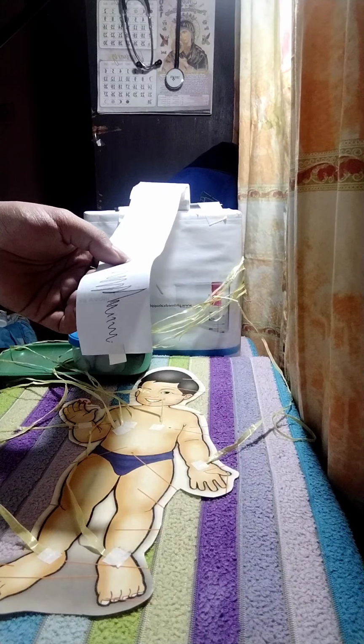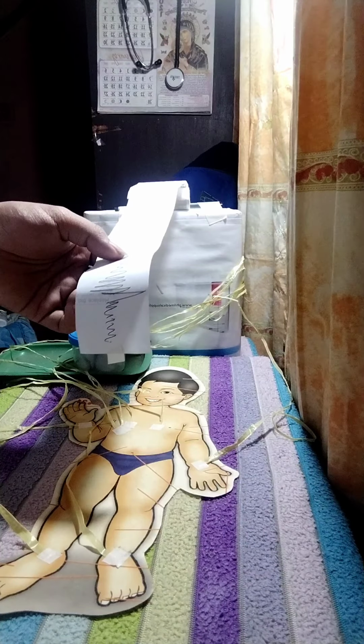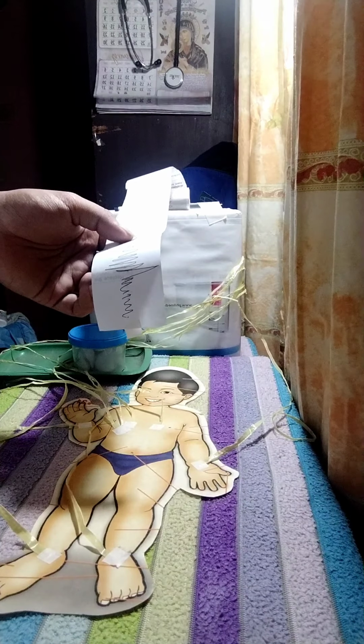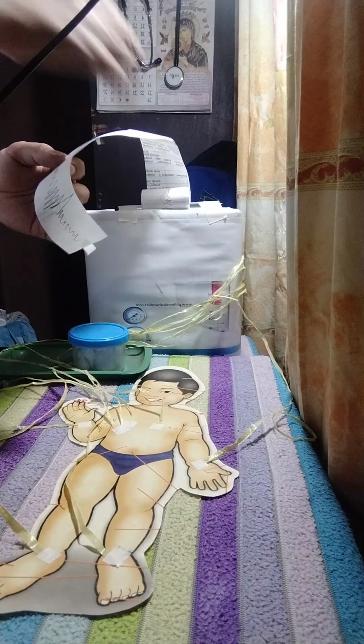Next, when the machine finishes recording all the 12 lead ECG, remove the electrodes and clean the patient's skin if necessary with adhesive remover for sticky residue.